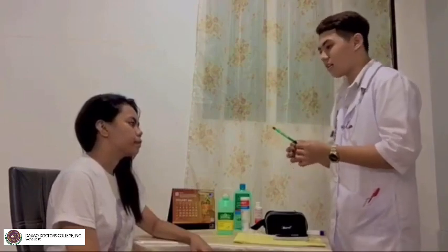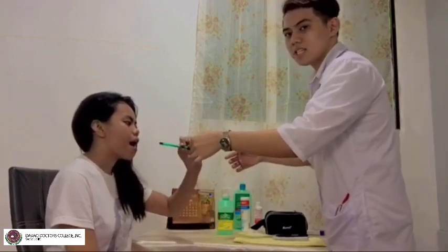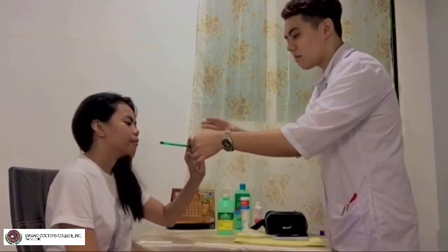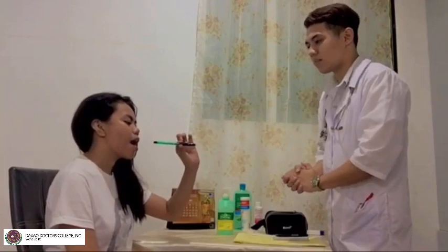Okay, ma'am, so since na-sanitize na ako aning oral thermometer, can you please open your mouth? Okay. Sige. This is just an imaginary demonstration. Okay, ma'am, pwede ni mo gunitan? Okay, thank you very much for cooperation, ma'am.